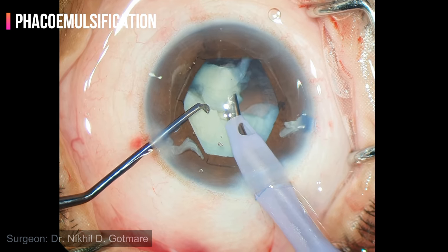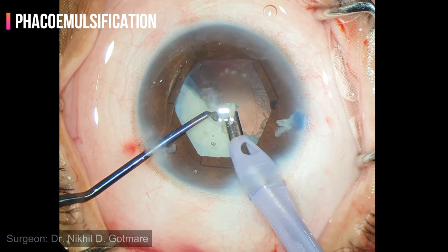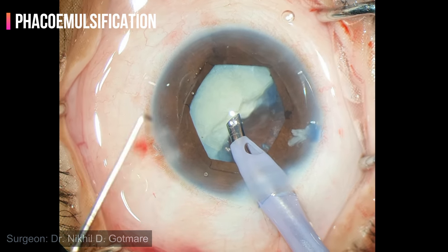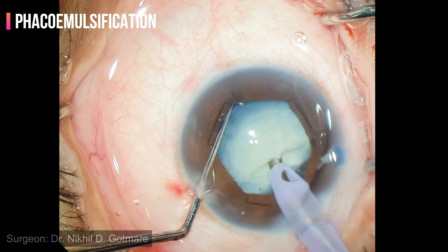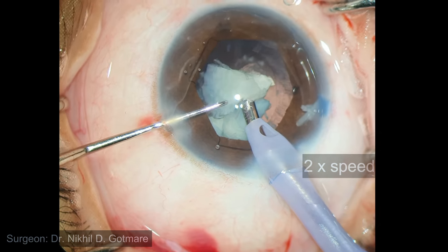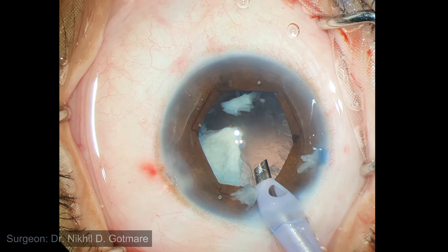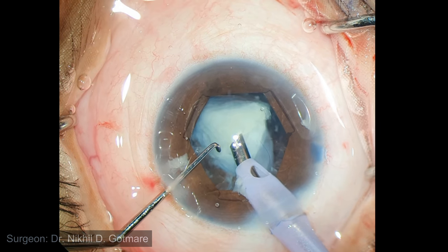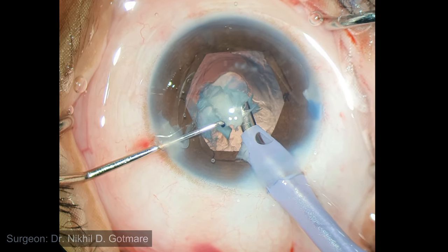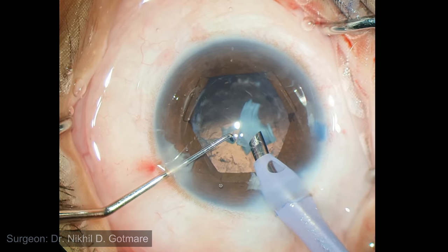In total cataracts, there is no epi-nucleus sheet protecting the posterior capsule, so emulsification needs to be very controlled. Once enough space is created, even a blunt Sinskey hook can be used to achieve horizontal chop of the nucleus. Before removing the last piece, viscoelastic is injected — this viscoelastic will act as an artificial epi-nucleus, keeping the posterior capsule away from the operating plane. Emulsification of the last piece has to be done in a very controlled manner to avoid sudden collapse of the anterior chamber, which can result in a posterior capsule rent.